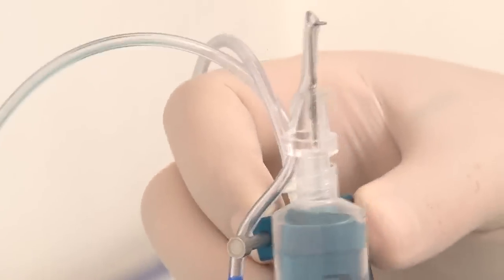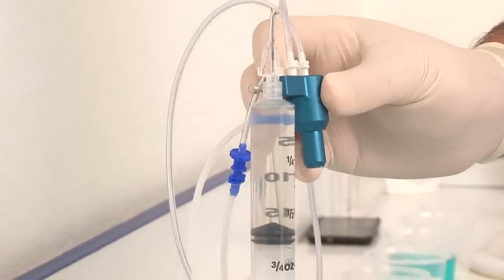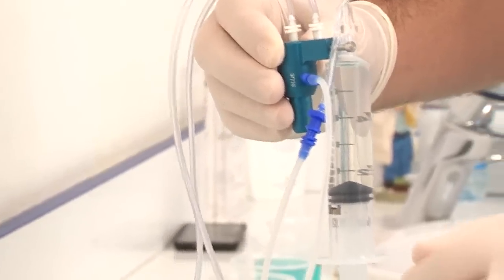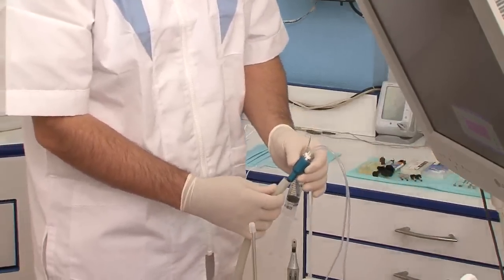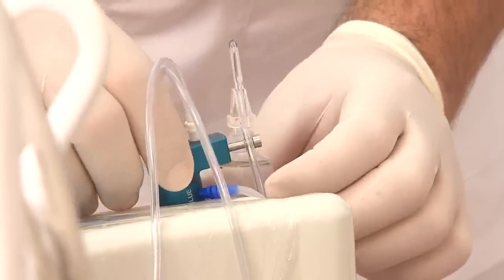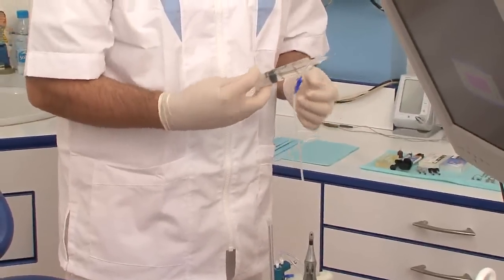And the main unit can look like this once we adapt it. We connect it to the main suction or to the surgical suction. We can adapt it to the main tube by itself or through an adapter, and it can be fit on your dental unit. And now the system is ready for the irrigation.